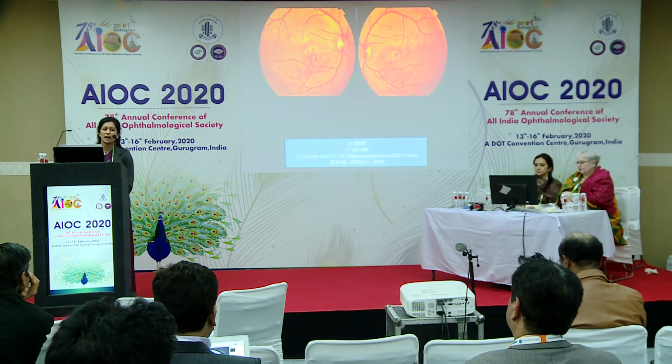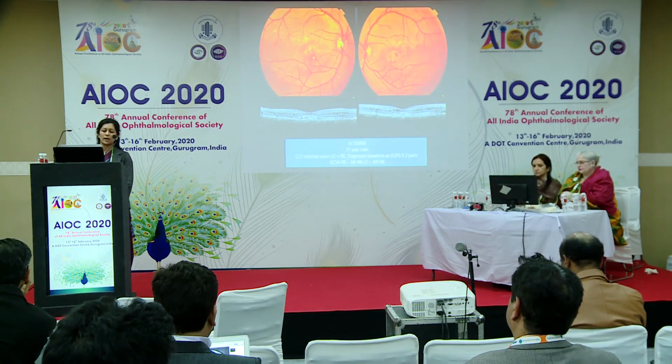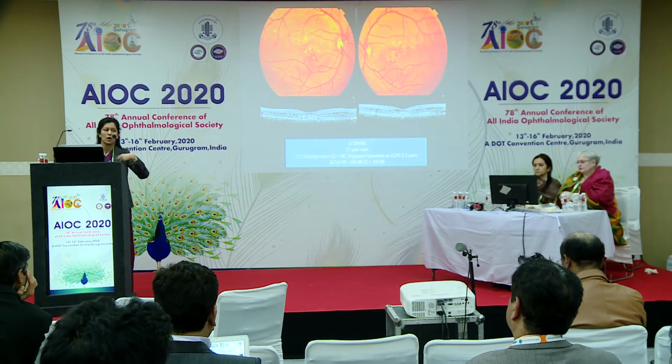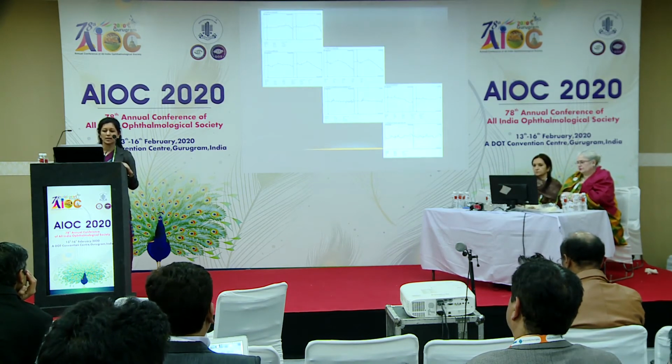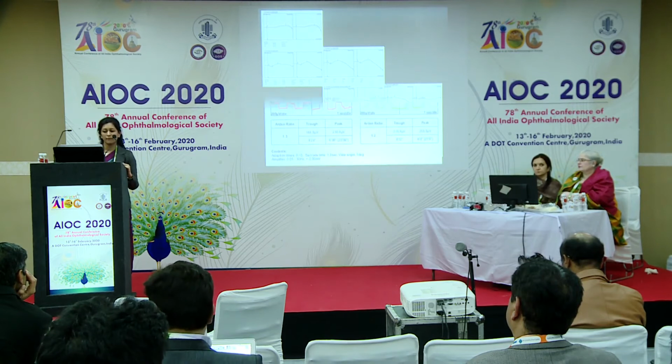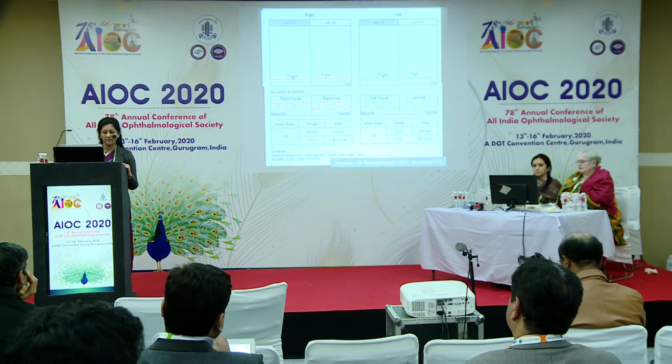And sometimes we have these kind of atypical cases where, in addition to the vitelliform lesion, you have cysts in the retina. So this is again what we are recognizing more as the autosomal recessive bestrophinopathy, where in addition to the EOG, you see that the full field ERG is also affected.